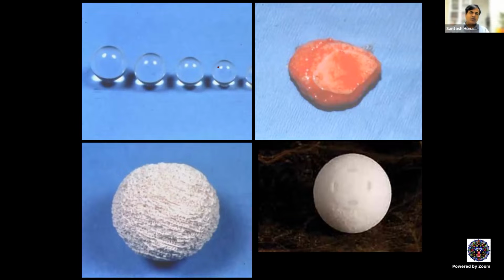So currently what is used is this. This for sure, this is the sphere implant. This is the most commonly used implant. There was a peak in the 70s, 80s, 90s as hydroxyapatite and porous polyethylene started coming up. Everybody started jumping onto the bandwagon and started using these implants, but soon realized that these implants have a higher chance of implant exposure and extrusion.